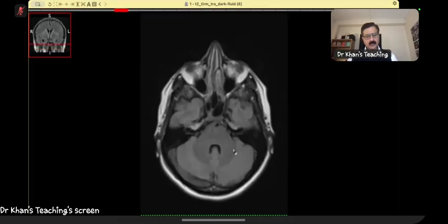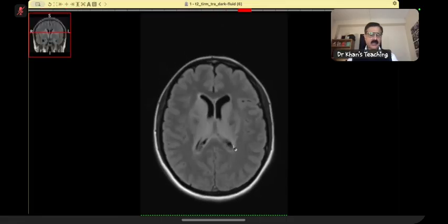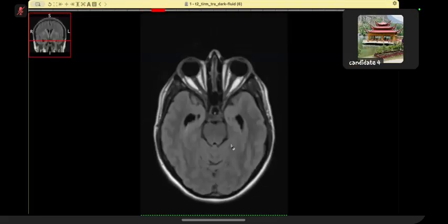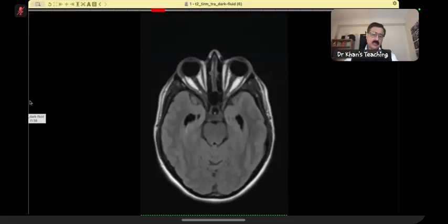You were just giving me the diagnosis. So dengue, what else? Viral? Anything else? Sir, autoimmune, and herpes is less likely because the temporal lobes are not predominantly involved. Okay, thank you very much.